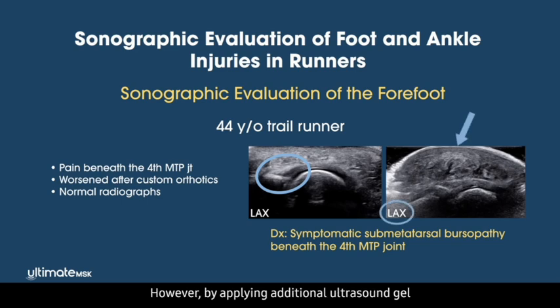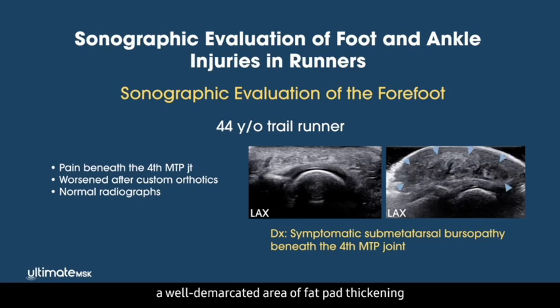However, by applying additional ultrasound gel and lightening transducer pressure, a well-demarcated area of fat pad thickening with increased hypoechogenicity was better appreciated and consistent with a submetatarsal bursopathy. This was likely the primary source of her symptoms, which improved with shoe insert modifications to offload the affected area.